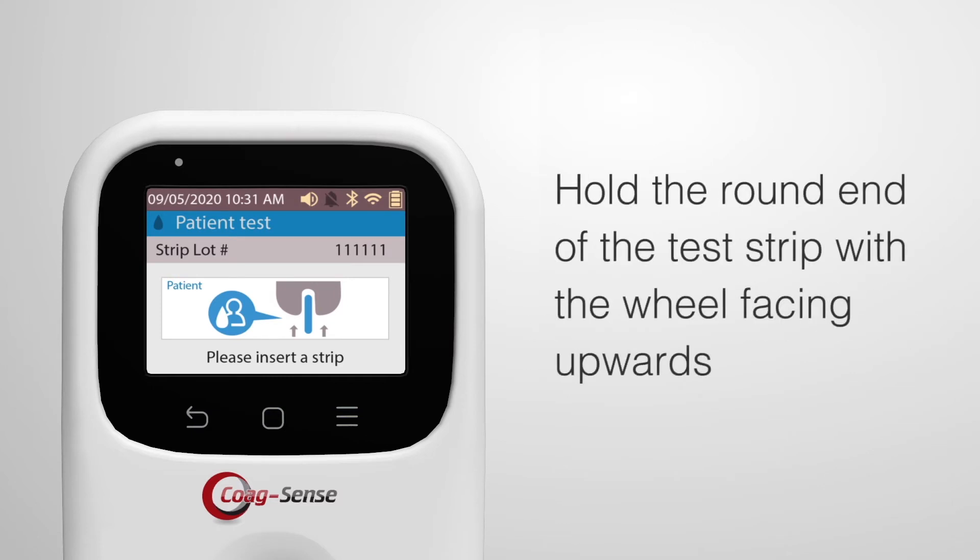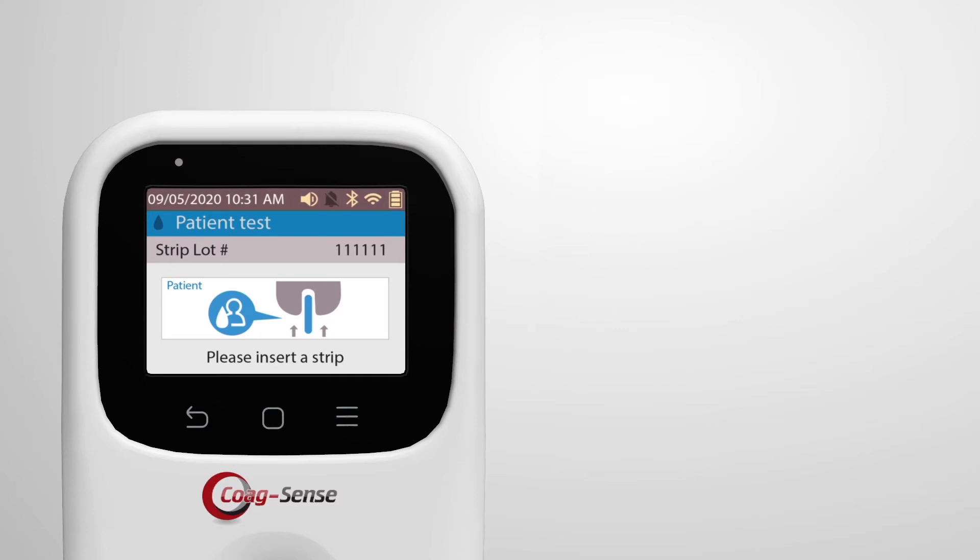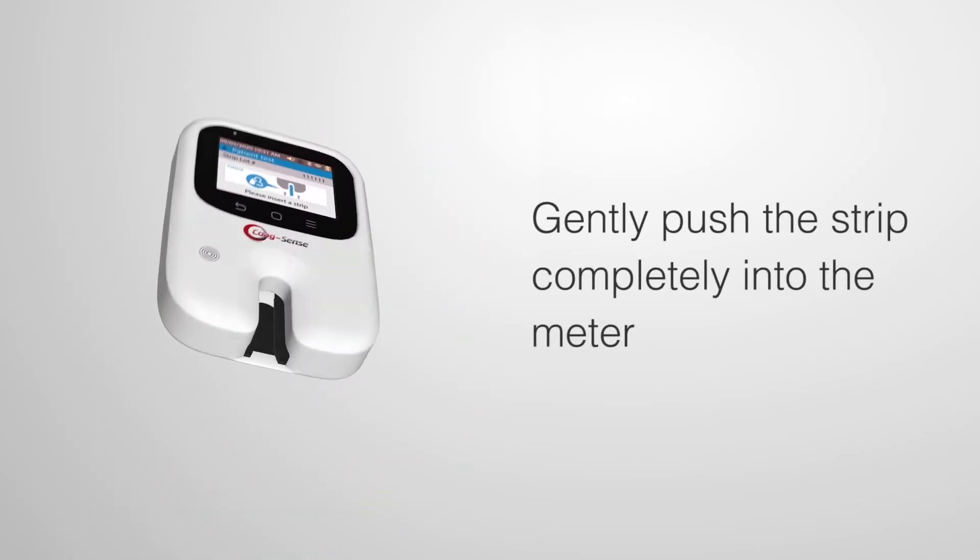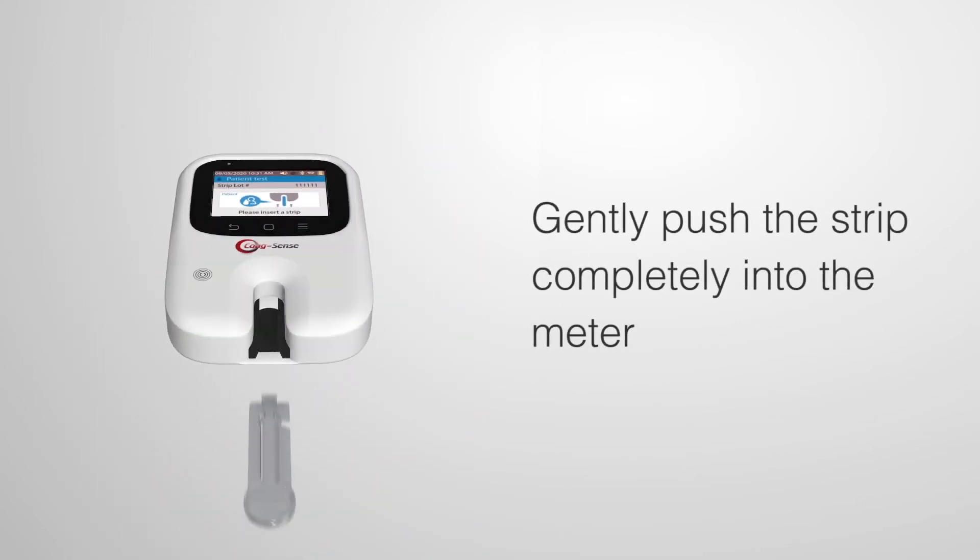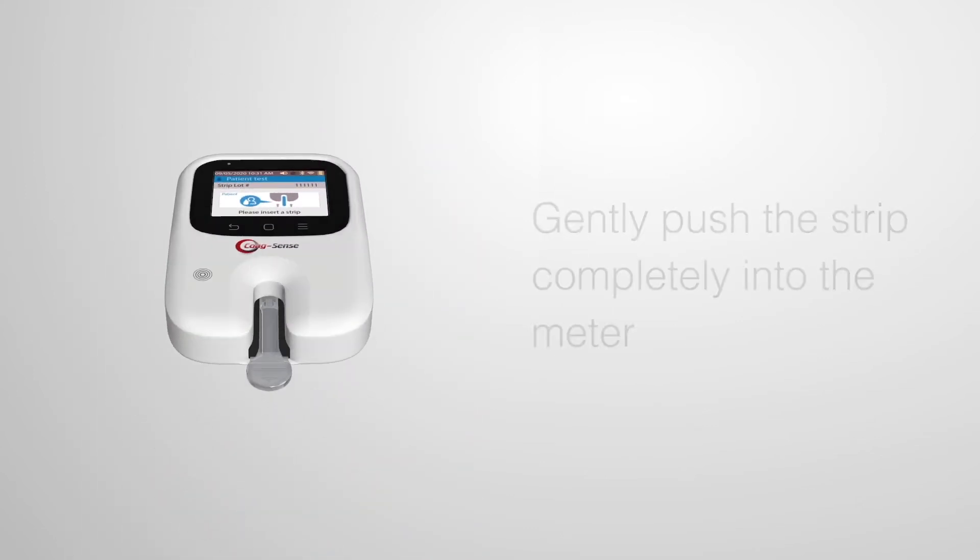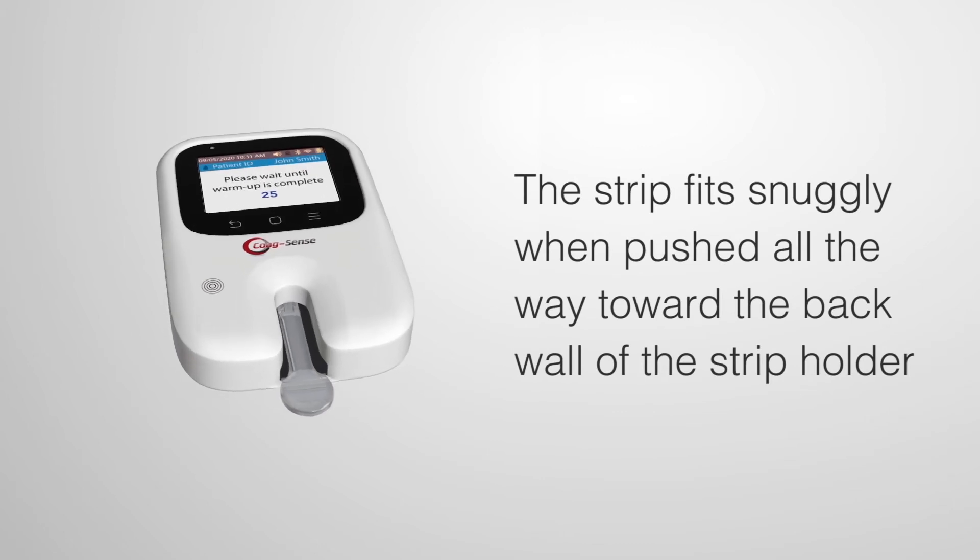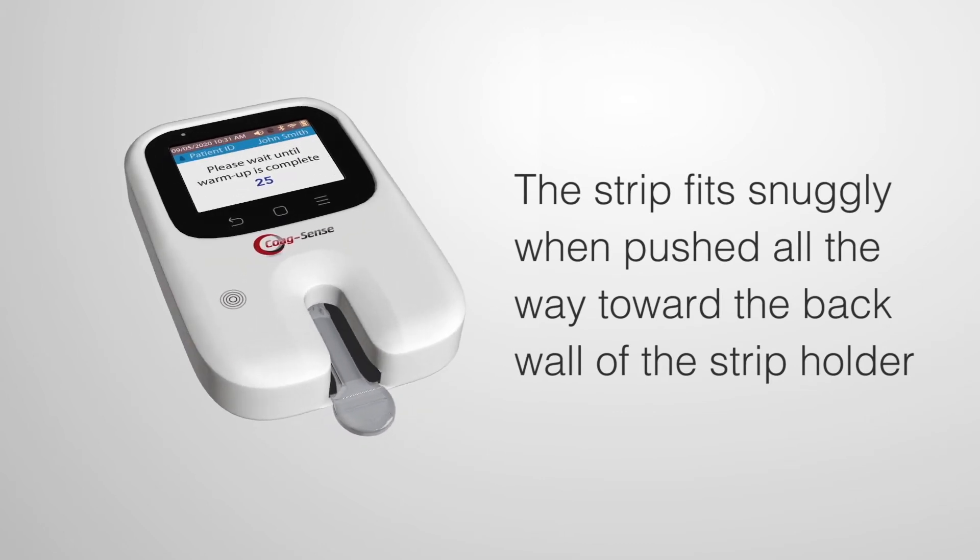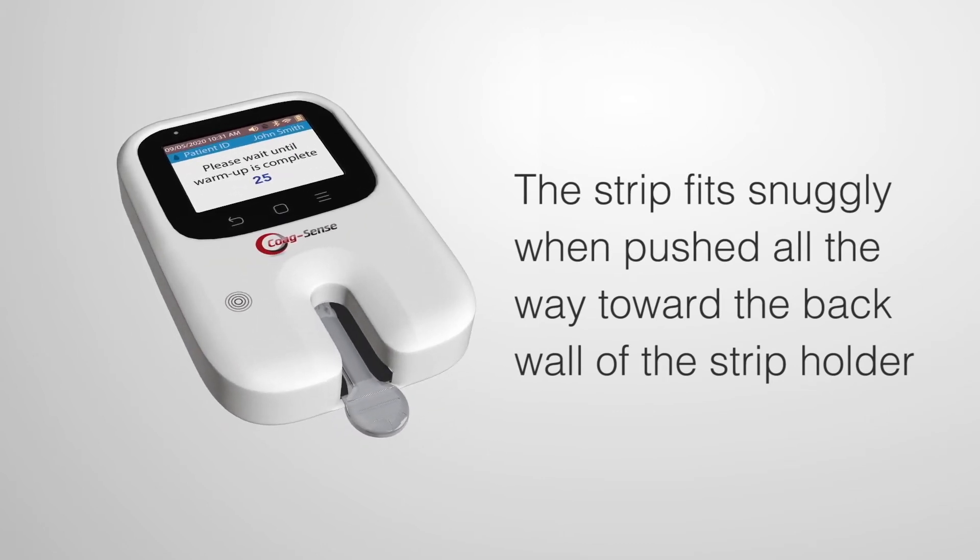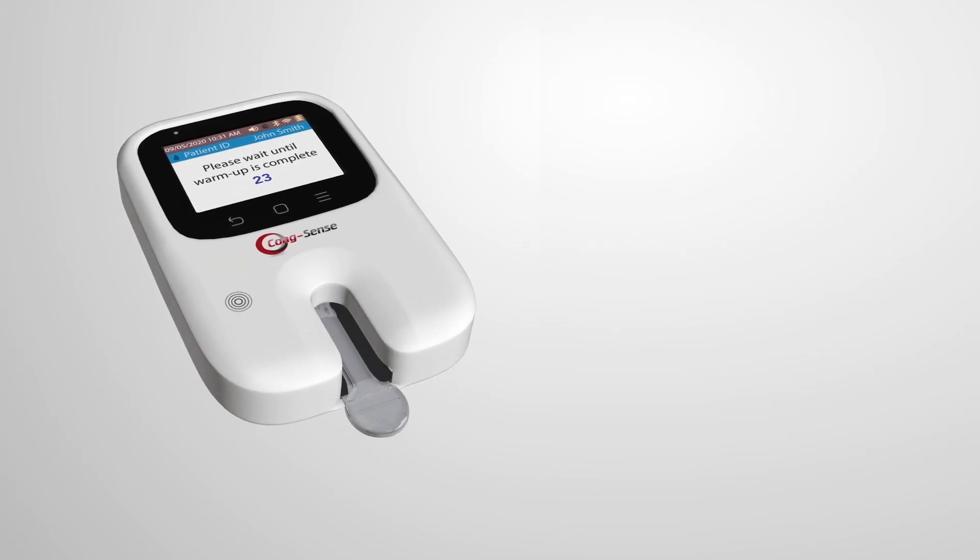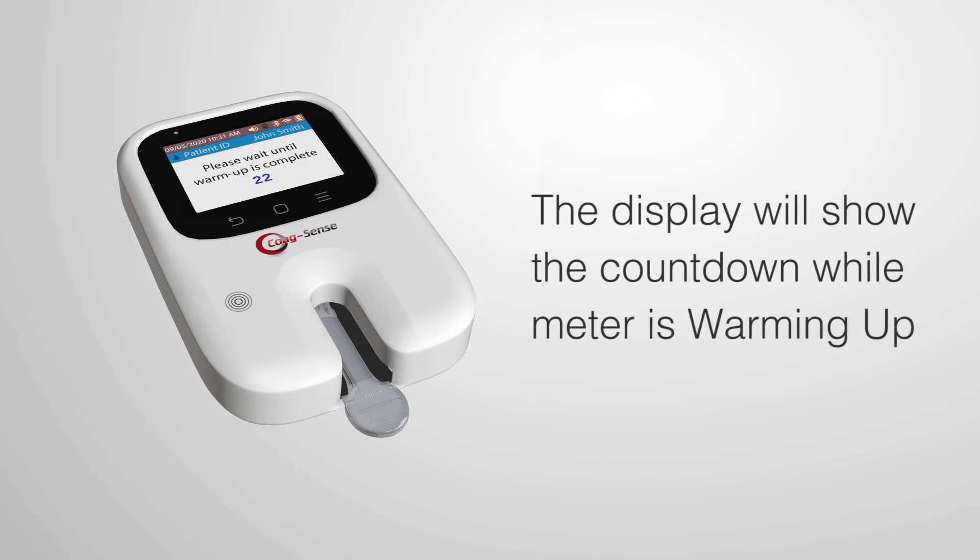Hold the round end of the test strip with the wheel facing upwards. Gently push the strip completely into the meter. The strip fits snugly when pushed all the way toward the back wall of the strip holder. The display will show the countdown while meter is warming up.